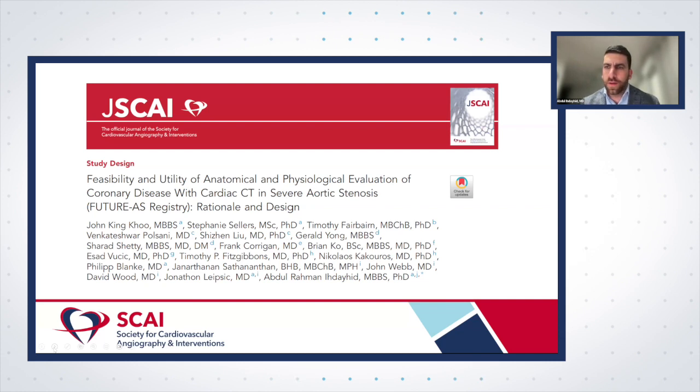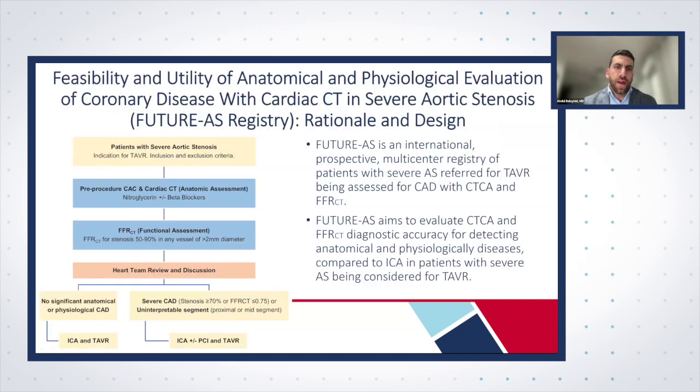Yeah, thank you very much, Jonathon, for the kind introduction and for the opportunity to share this podium with you. So look, the rationale for what we're doing here is we're trying to find a better way to diagnose and evaluate coronary artery disease in patients undergoing TAVI. Coronary artery disease assessment is really an essential part of the heart team discussion as we risk stratify patients who are being considered for TAVI. And traditionally, in many parts of the world, part of that journey has been an invasive angiogram. And an invasive angiogram is still a costly procedure.